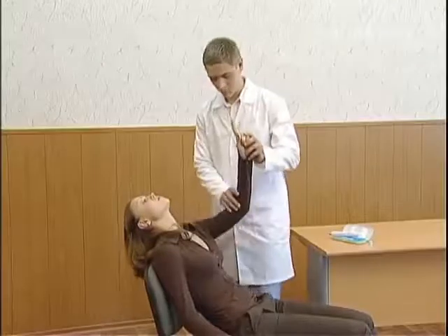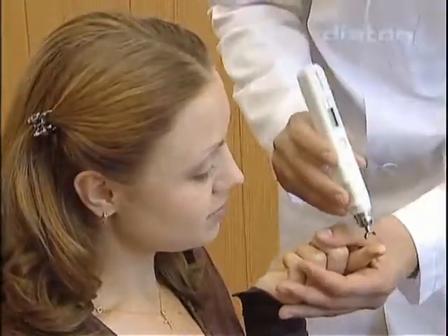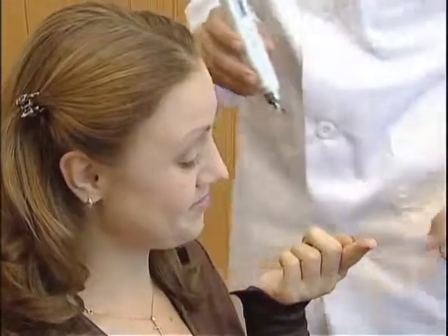If this is the patient's first measurement of IOP by the Diaton tonometer, it is recommended to demonstrate the tonometer's painless effect to the patient — for instance, on the finger's pad.